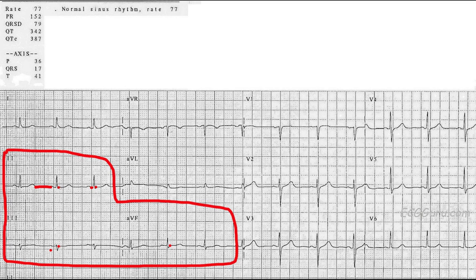Another thing we want to see in a normal ECG is that the ST segments have a generally concave upward appearance — kind of like a little smile. They might be a little flat in some leads. Flat isn't good and convex upward isn't good — it would look like a frown. But once in a while, especially in right-sided leads like V1 and lead three, a little flattening isn't anything to worry about. Look at the entire ECG for a general feeling of concave upward and J points not elevated.